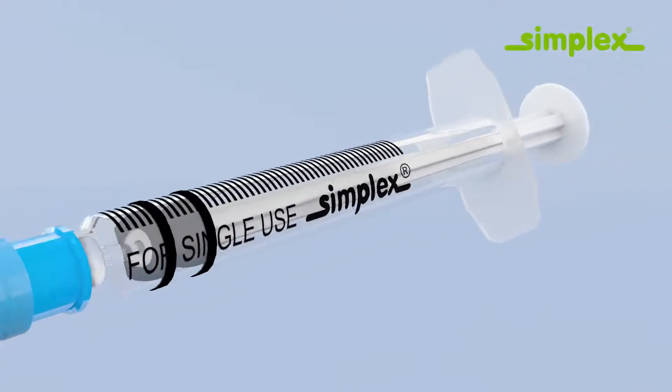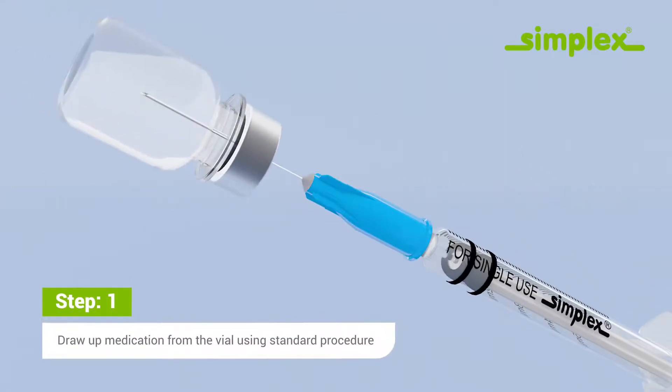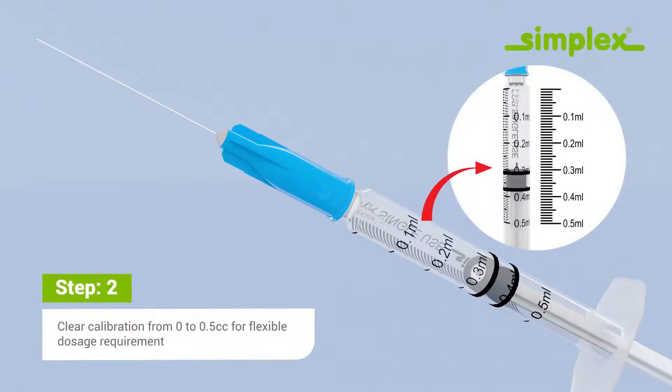Draw up medication from the vial using standard procedure, with clear calibration from 0 to 0.5 cc allowing flexible dosage.